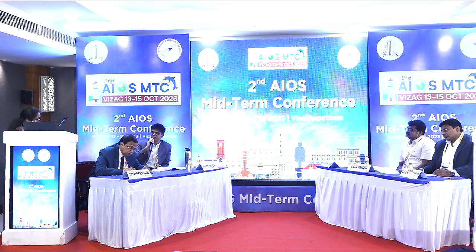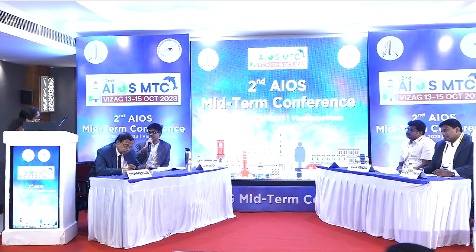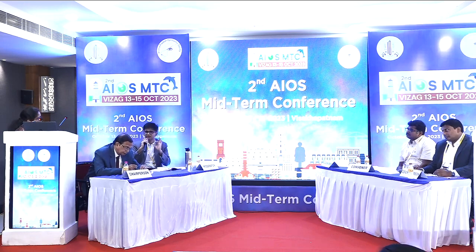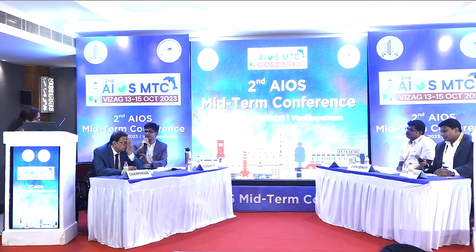In monitoring of papilledema, always a person has to look at both RNFL as well as macular GCL thickness, and GCL thickness can be erroneously wrong. So you have to do a separate segmentation in papilledema. Okay, so it's an important message, but it should be taken with caution with what you have concluded.